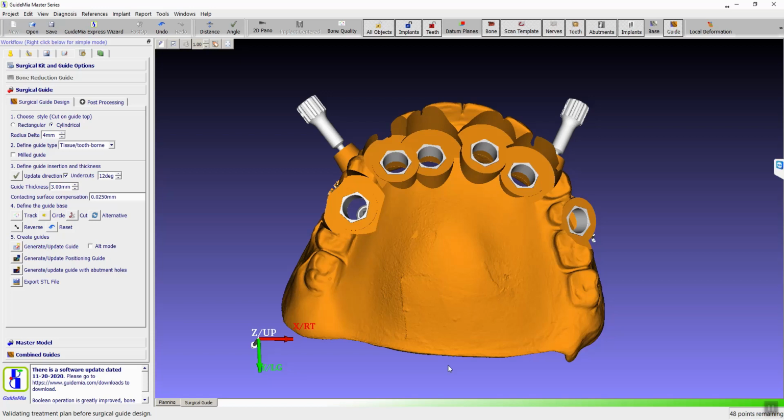So we are a little concerned about that. We'll work on that. If we just want to go that way, we should be really quick. But we'll keep working on that still.